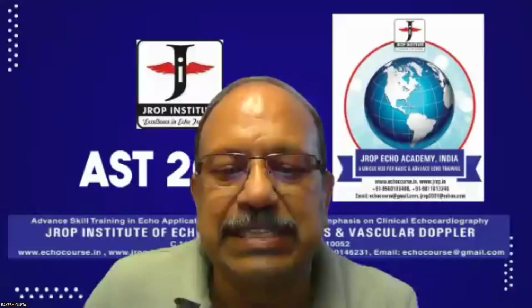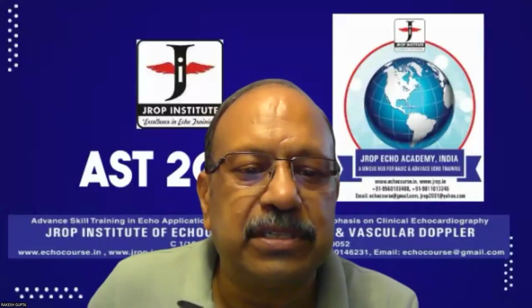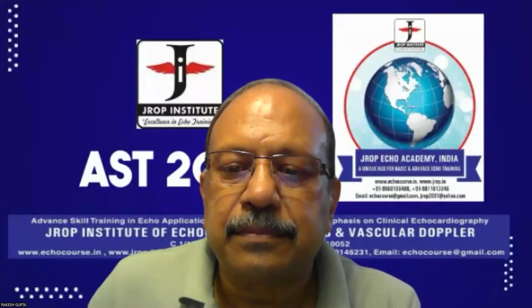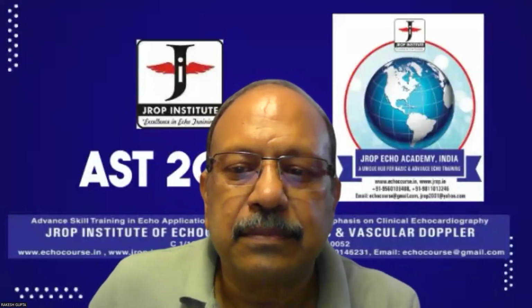Sir, in aortic stenosis, I screened one patient today. She had a pacemaker and severe tricuspid regurgitation. I found aortic stenosis also on the gradient basis. On M mode, she had that sawtooth appearance on the aortic box, but I was not able to get the aortic regurgitation jet. Sawtooth appearance is aortic regurgitation. So we have to consider that she has AR. Right, I have to screen again for the AR jet. Thank you, sir.